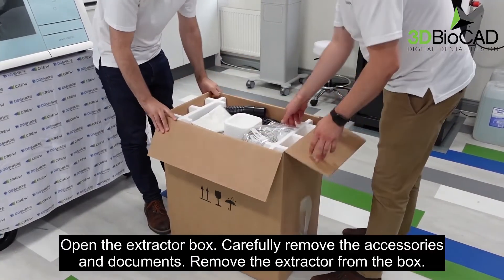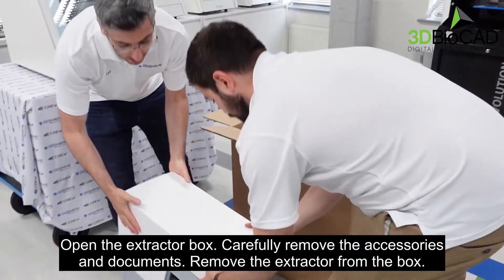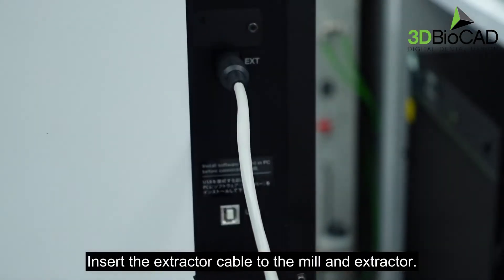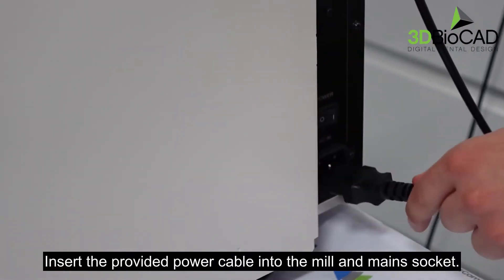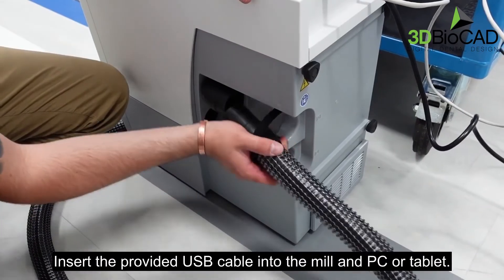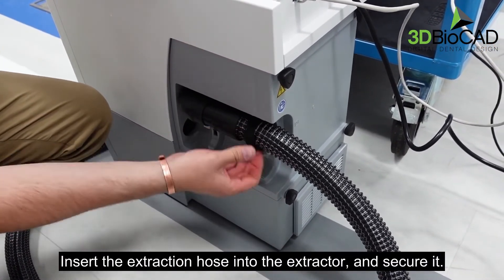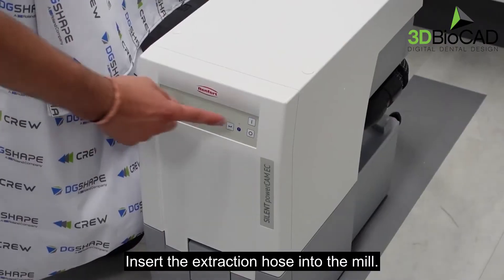Open the extractor box and carefully remove the accessories and documents, then remove the extractor from the box. Pay attention to the new cable design. Insert the extractor cable to the mill and extractor. Insert the provided power cable into the mill and main socket. Insert the provided USB cable into the mill and PC or tablet. Insert the extraction hose into the extractor and secure, then insert the extraction hose into the mill. Plug in and power the extractor.